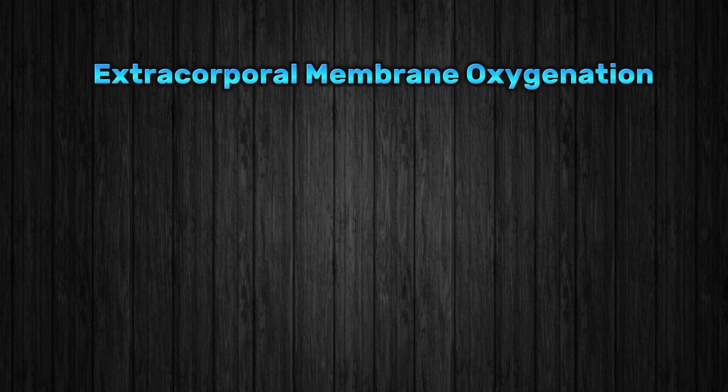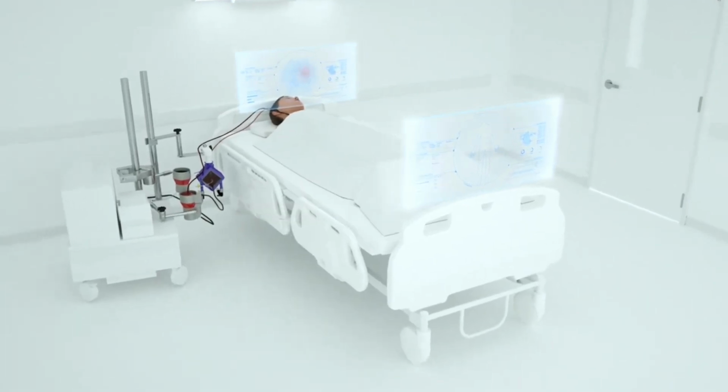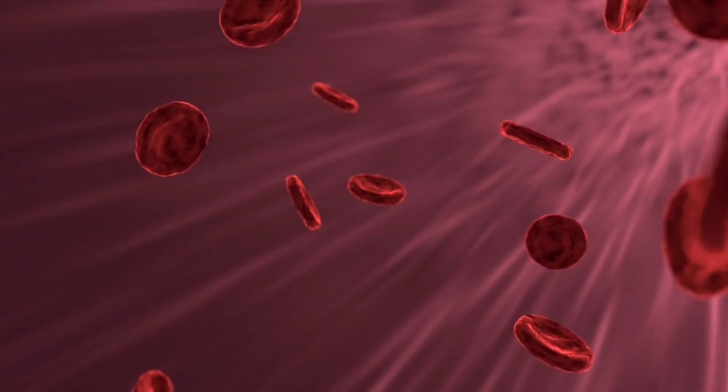Okay, we are going to discuss extracorporeal membrane oxygenation (ECMO). It is a technique of providing prolonged cardiac and respiratory support to a person whose heart and lungs are unable to provide an adequate amount of gas exchange or perfusion to sustain life.